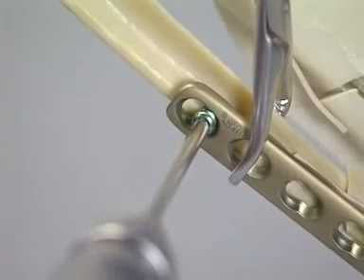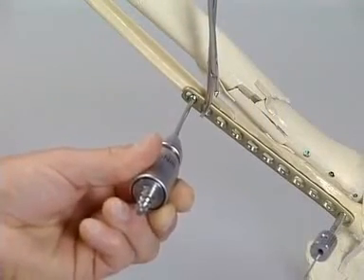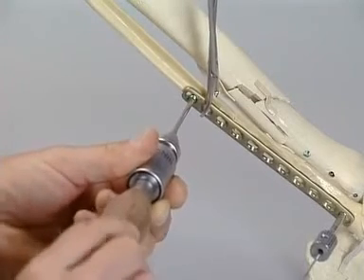The last few turns are again made by hand, so the air drive is disconnected from the torque limiting attachment and the handle is attached. The locking head screw is completely tightened.